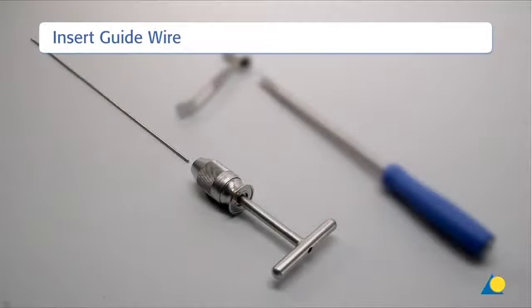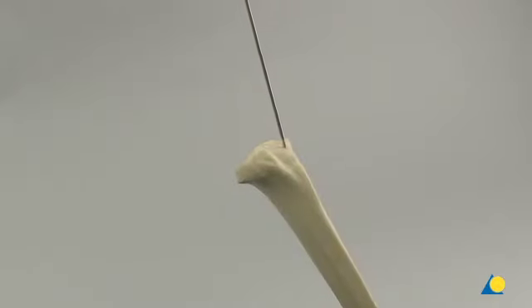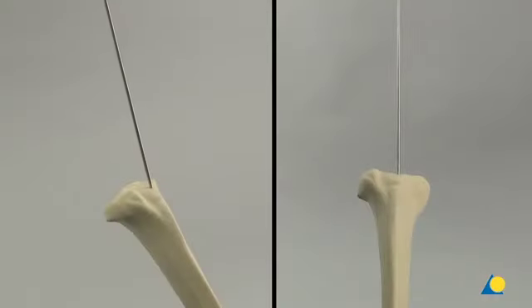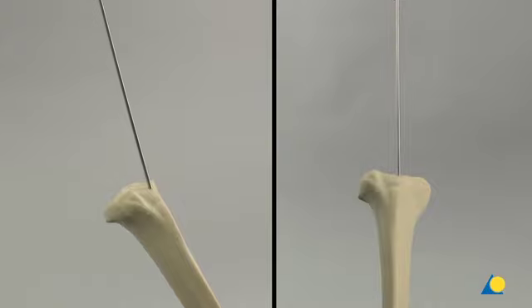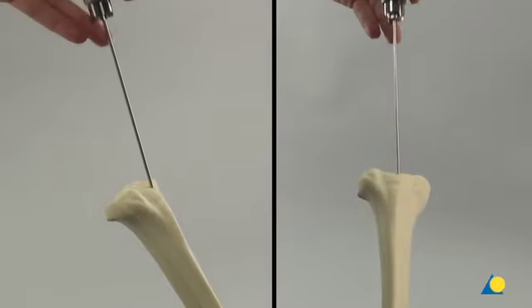The instruments used to insert the guide wire are the guide wire, 3.2 mm diameter, and the universal chuck with T-handle. The guide wire is secured in the chuck. The insertion point is slightly punch-marked at a 10-degree angle to the shaft axis in the lateral view. The guide wire is inserted approximately 8 to 10 centimeters and its position is checked under image intensification in the AP and lateral views.